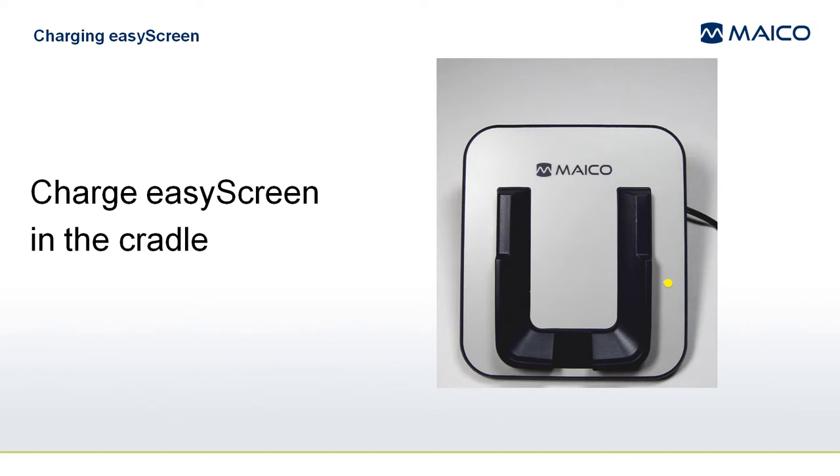The first step in assembling your system should be to fully charge the EasyScreen. The fastest way to charge it is to place it on the power charging cradle. Connect the plug adapter suited for your region onto the cradle power supply and insert the micro USB plug into the micro USB port on the back of the cradle.